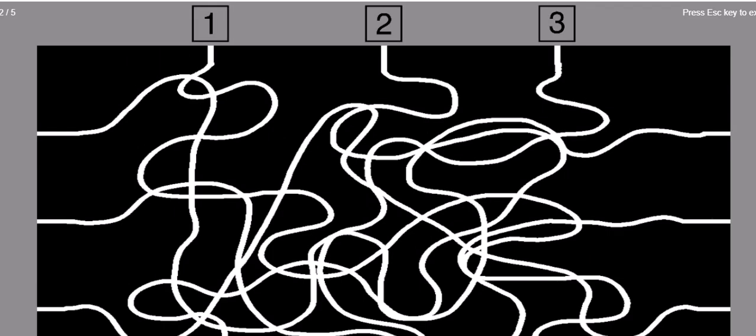So you're going to want him to use his eyes to, it's a little bit outside of the screen here that I've recorded, but where my arrow is, there's a green arrow pointing for them to follow this line with just their eyes. And they're going to point down to the number that it ends up at. So it goes to 3, and then they'll follow this through and they'll press the number that the line comes out at. So I have them doing this for about 5 rounds.